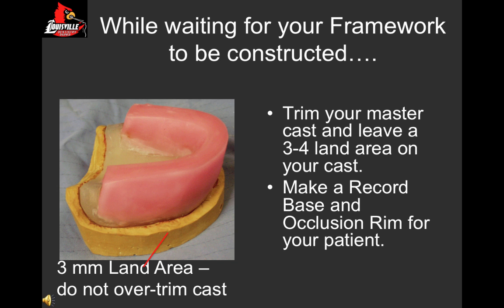Follow the instructions in the complete denture manual and prepare a record base and occlusion rim on your maxillary master cast. The goal when treating a complete denture patient over a removable partial denture is to have the occlusion rim on the maxillary arch ready when you're ready to add a record base to your partial denture framework on the lower arch. You do not start with the maxillary arch before constructing your framework because you don't want that maxillary master impression sitting around for weeks before you're ready to use it. If you had maxillary arch extractions, this provides more healing and shrinkage time for the maxillary arch.